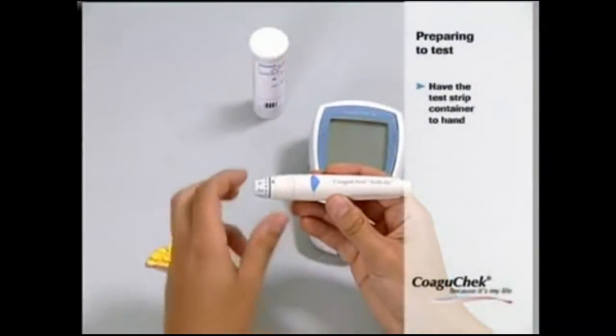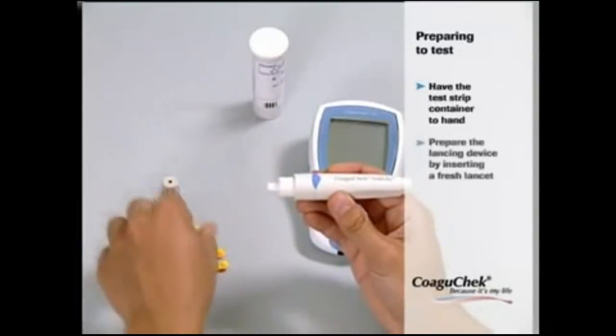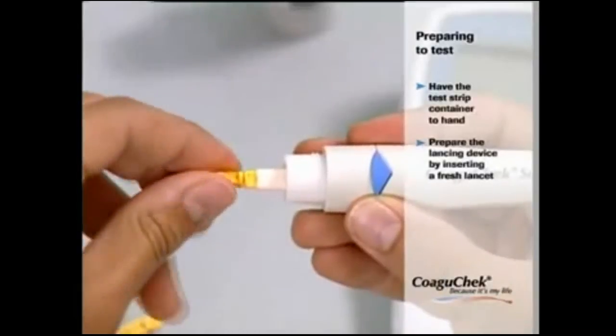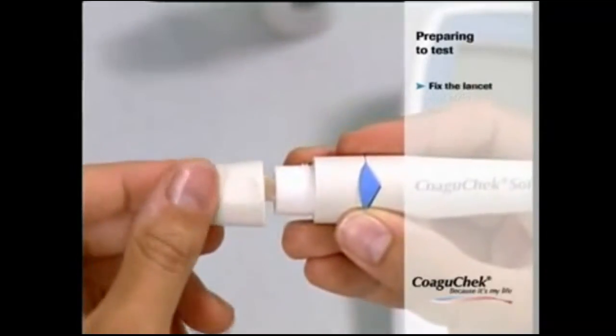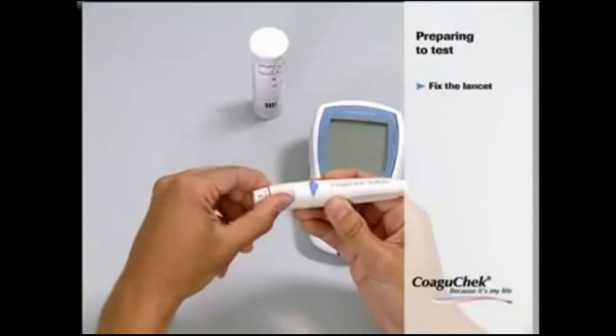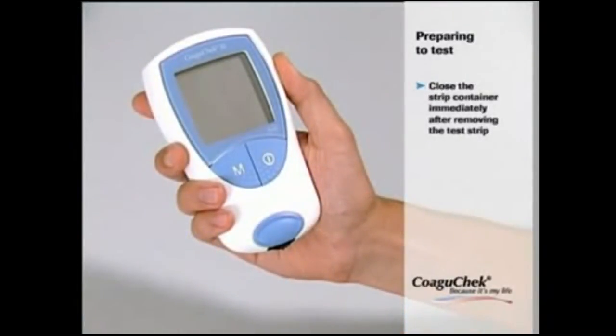Before you start testing, please wash your hands with soap and warm water and dry thoroughly. Now you are ready to prepare the lancing by inserting a fresh lancet into the lancing device. Fix the lancet and keep the device nearby. Place the monitor on a level, vibration-free surface or hold it roughly horizontal, and have the test strip container to hand.